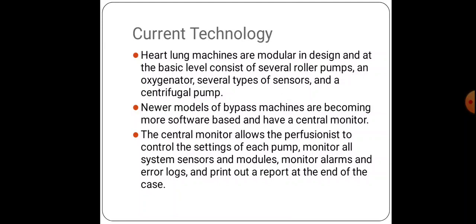So with the help of the central monitor, from his place itself, the perfusionist can access and control all the components involved in the heart-lung machine. So this is the current technology. In modular technology, we have to sit beside the heart-lung machine to control all these parameters.